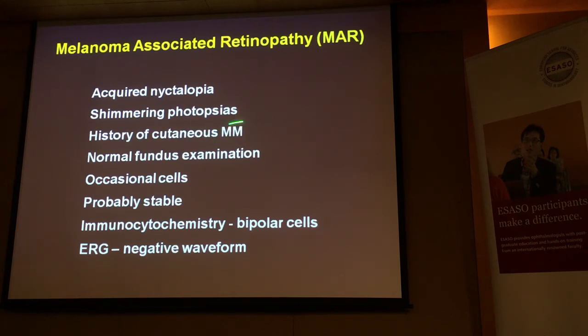They usually have a history of cutaneous malignant melanoma, but every now and then you get a patient who says, oh yeah, I had a pigmented mole removed. So we always ask that specific question. Somebody comes in with shimmering photopsias and acquired night blindness, they may not have been told that it was an MAR. And their ERG is distinctive.